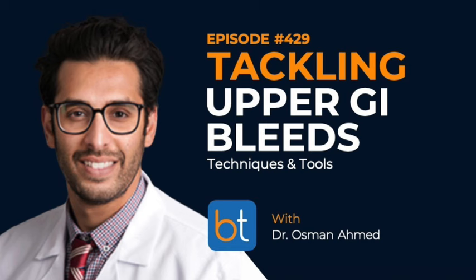Because you don't, like you said, especially if they're clamped down, otherwise you end up with a lot of reflux and a kind of mixed picture. So you've got to try and get it right. But sometimes when you know exactly where the bleed is, it's nice if your Cobra just pops down into that common hepatic, and then you can do a nice run from there too, especially if you know it's off the GDA.